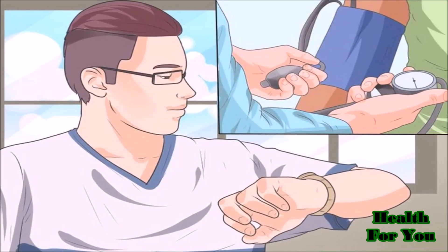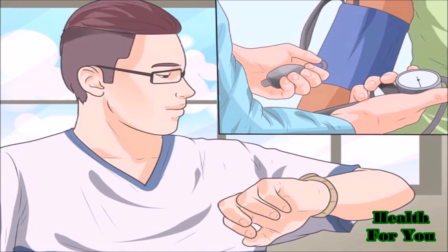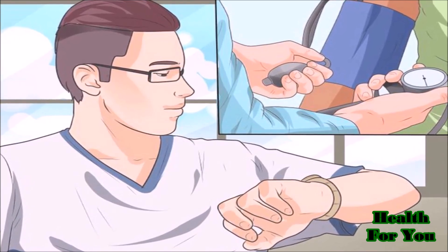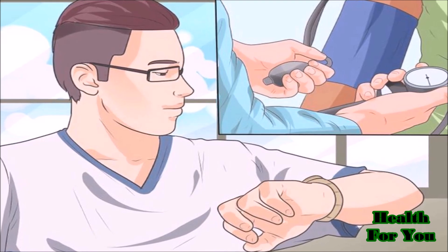Let the cuff completely deflate. It is very important to double-check the reading for accuracy. After 5 to 10 minutes, follow the same steps to take another measurement.